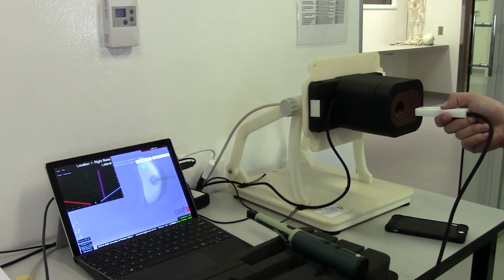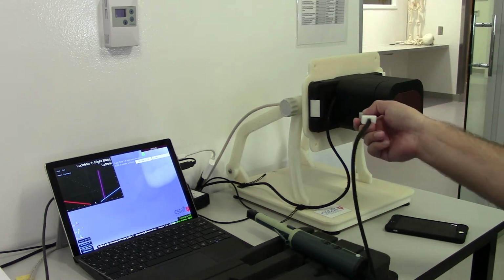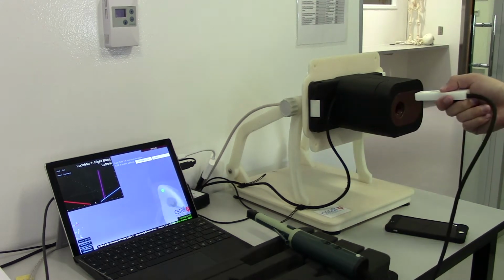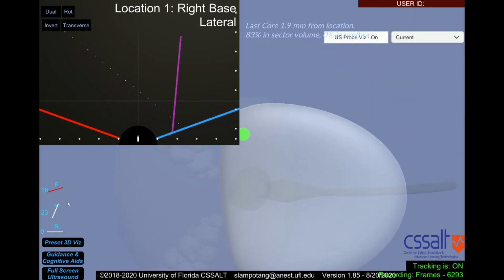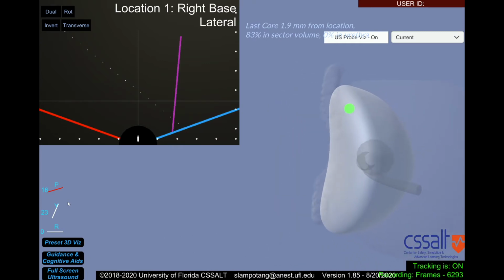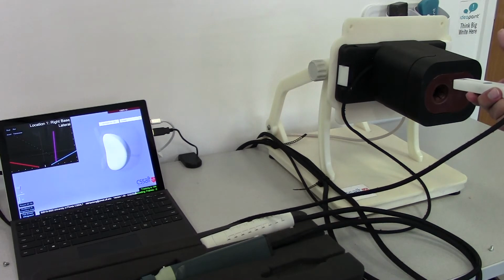The viewpoint of the virtual model can be controlled with presets of the virtual camera position or by using the virtual camera pointer, also called the tangible user interface. Hold the button on the controller for the virtual camera and move around the physical model. The virtual camera viewpoint will follow the controller and move around the virtual model. Release the button to freeze the virtual camera position.